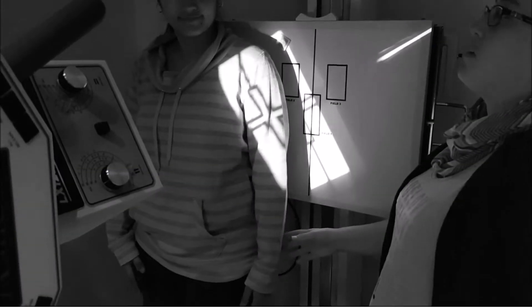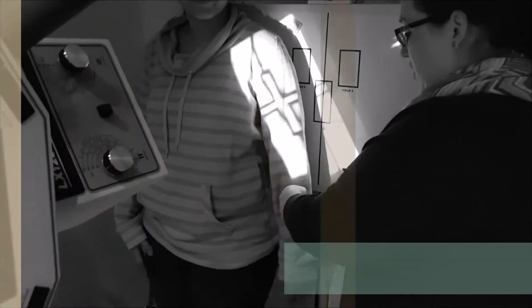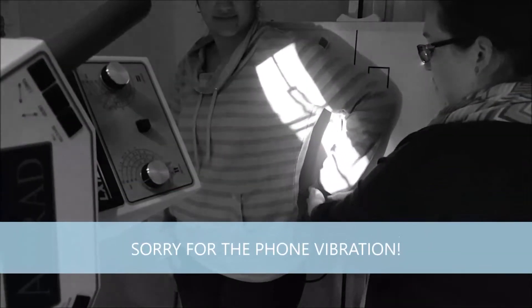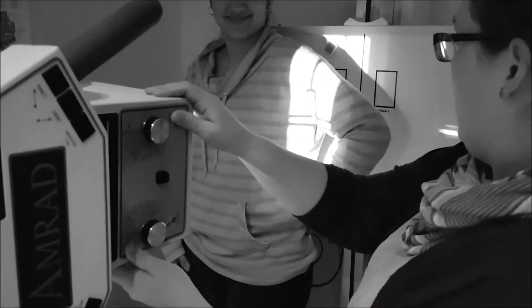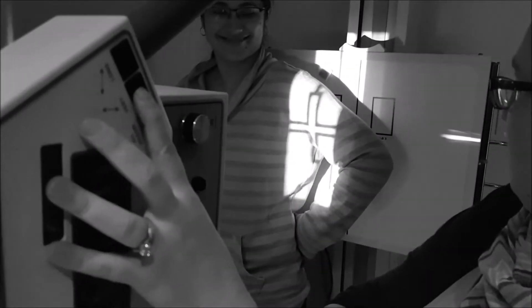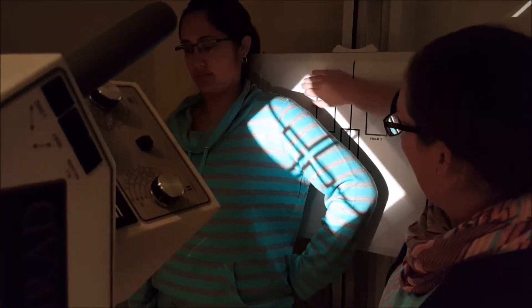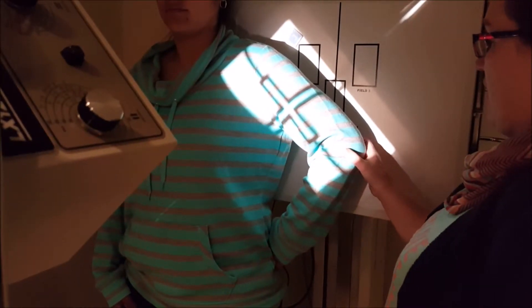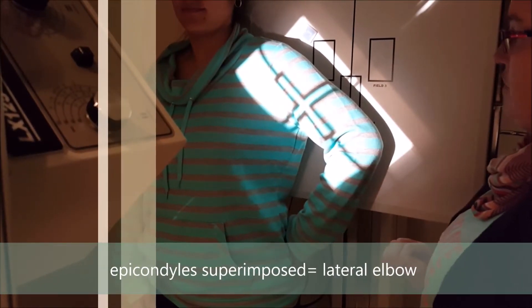For the lateral humerus, we're still in the same position as the AP. What we're going to do is kind of chicken wing them — bring the back of the hand out so that way we're still on the same plane. I'm going to caulk the tube so that it matches the long axis of the arm. We are lined up to the bucky, with the elbow and the shoulder joint included. It's important to get the patient's arm so that the epicondyles of the humerus are superimposed as much as you can.